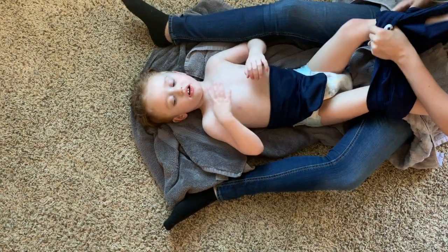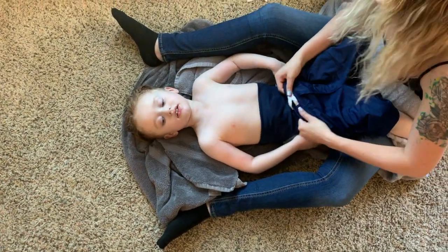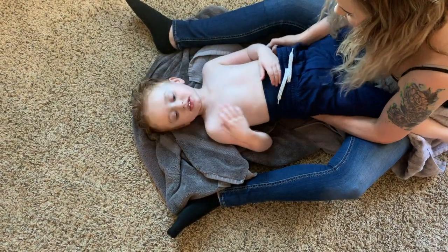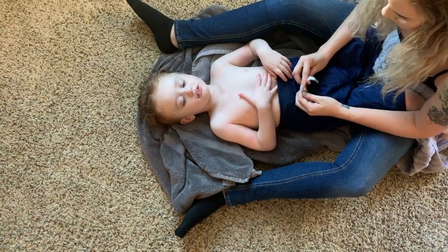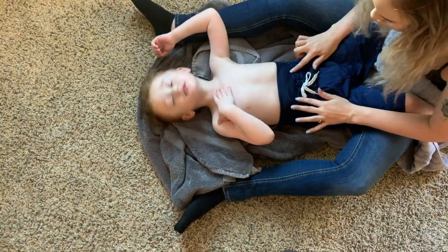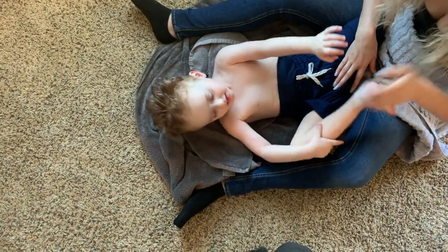And we have to change Keegan's ostomy bag and drain it, because I'll show you guys on an unused pouch here how it drains out the bottom. And so this lasts for, like we said, 3 to 4 days, and then we have to give him a bath and change it. Obviously you can't give baths on other days because the ostomy bag can't get wet. There are special baths for the ostomy bag getting wet, but as you can tell, it makes it very functional for everyday life.